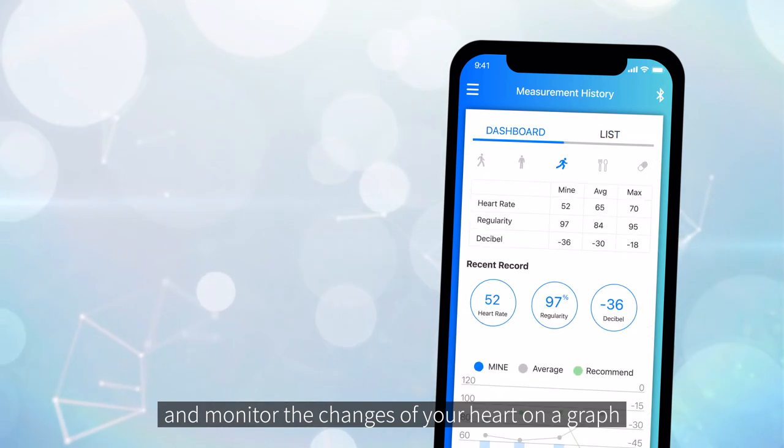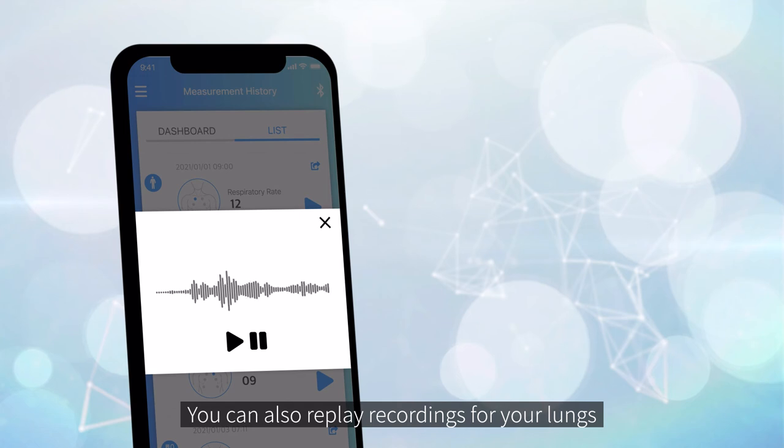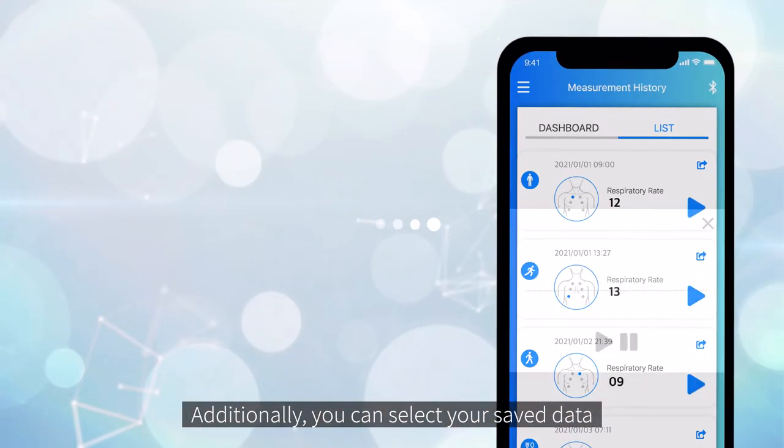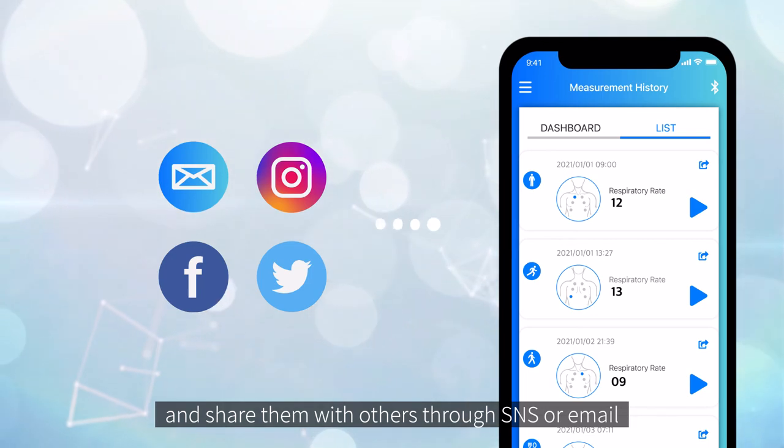On the history page, you can check your measurement results and monitor the changes of your heart on a graph. You can also replay recordings for your lungs. Additionally, you can select your saved data and share them with others through SNS or email.